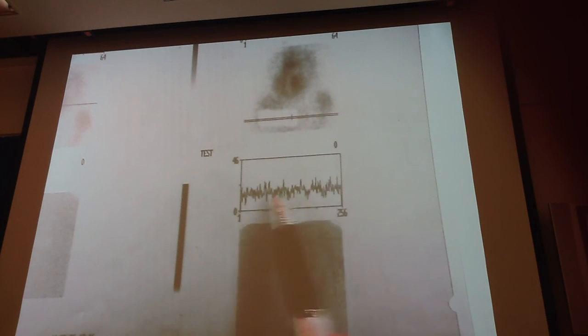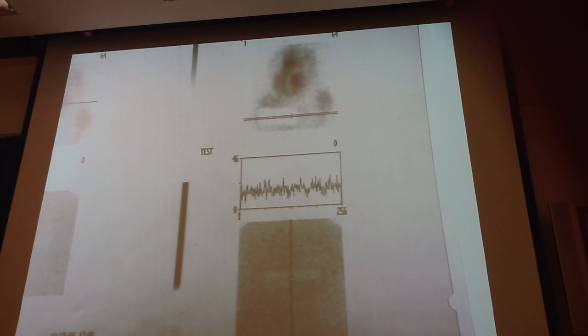But I just wanted you to understand that when you have noise, this would be a high-pass filter, and basically it gives you a sharp edge, provided you have enough information to have a picture.